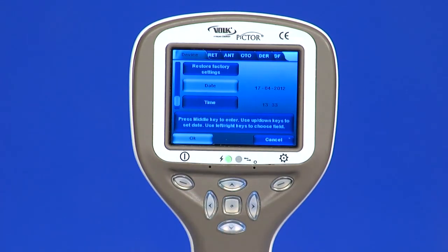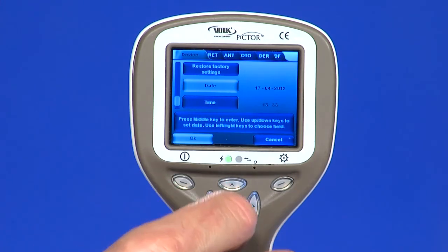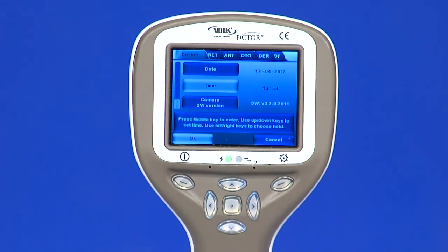Date: date can be set using the left and right arrow keys. Enable editing by using the middle key. Move between day, month, and year by pressing the middle key. Time: time can be set using the left and right arrow keys. Enable editing by using the middle key. Move between hours and minutes by pressing the middle key.